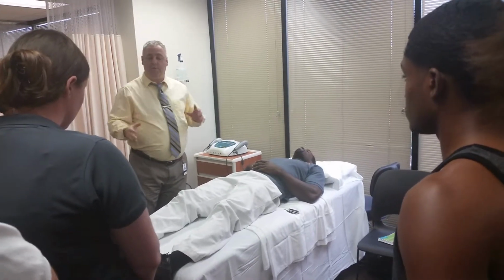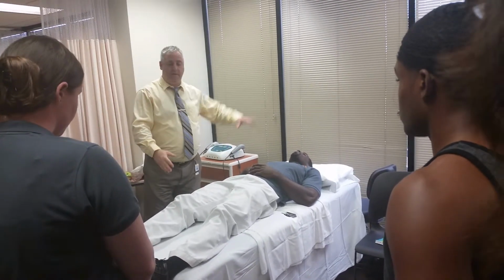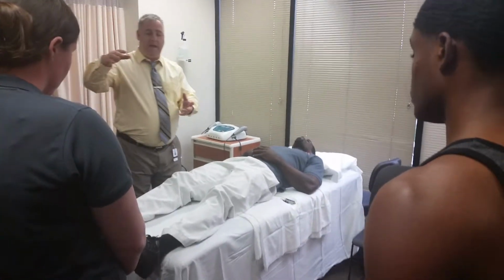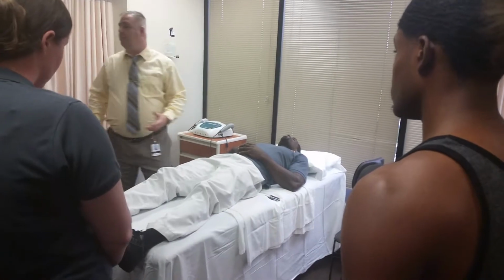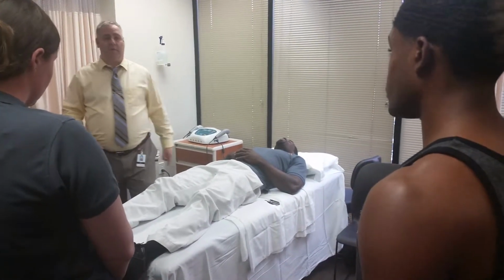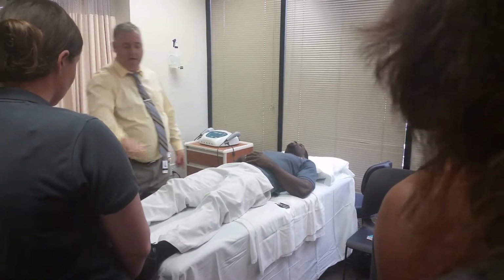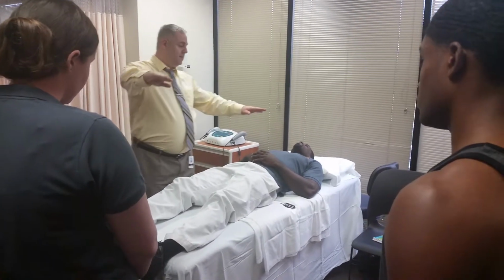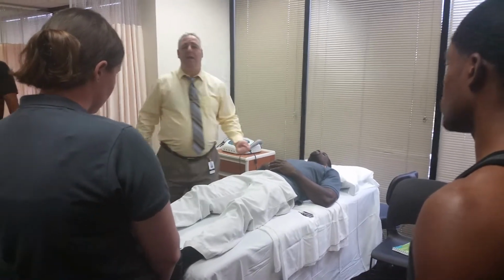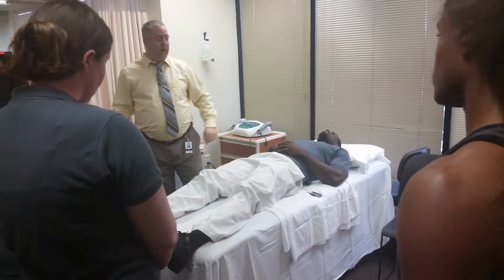The bed has upper and lower parts, so we can raise the foot part of it, or we could put the bed in what kind of position? Trendelenburg. That's a setting, and the bed comes up this high. His head is here, the bed is here, and we can move him down that way. It's a lot easier on us.